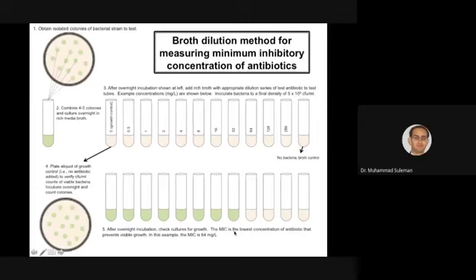minimum inhibitory concentration, which is in fact the lowest concentration of antibiotic that visibly prevents the growth of bacteria. और इस पूरे सारी ट्यूब्स में जो आपने देखा है that is 64 माइक्रोग्राम per ml जो आपको यहाँ पे नज़र आ रहा है। This is the tube, the dilution of the tube, like 32 is not inhibiting. यहाँ पर जो है वो जो ग्रीन कलर का बैक्टीरिया वो ग्रो कर गया, but at 64 it is the lowest concentration, जिसके बाद जो है वो सारे के सारे ट्यूब्स में there is an inhibition of growth. So this method is called as broth dilution method for antibiotic susceptibility.